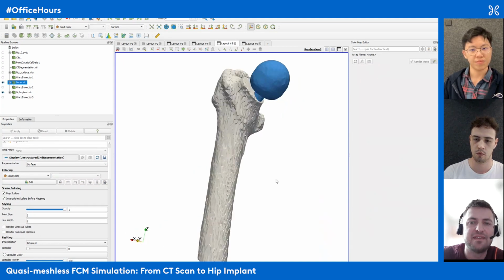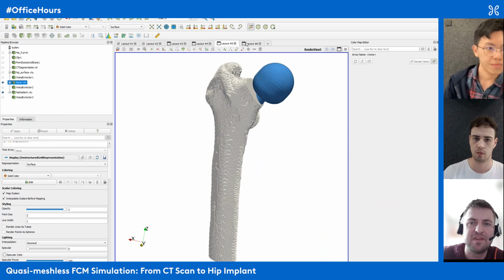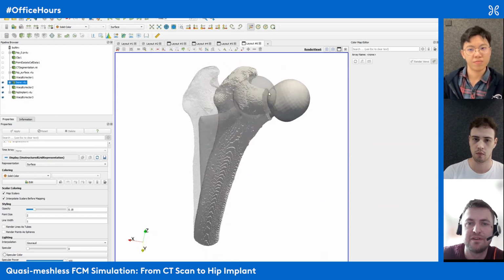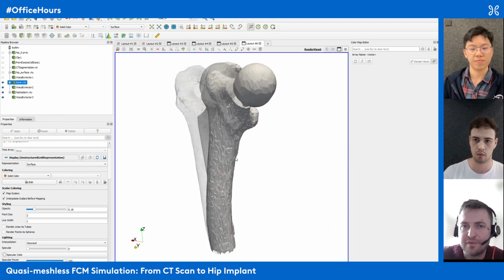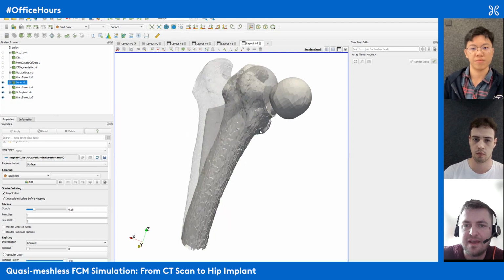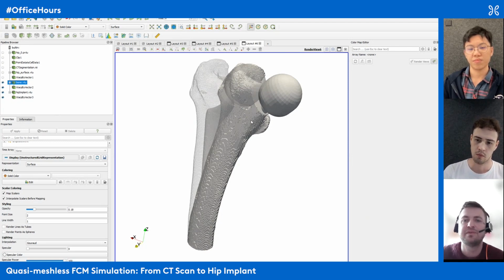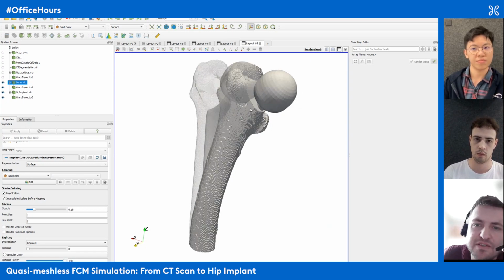I could maybe start from one kind and then look at how that implant shape can be inserted in that bone, and then maybe even look at how that implant plus bone together will deform. Look at the stresses, how the stresses would look in this situation, and then make a decision. Is it good enough or is it not good enough? If it's not good enough, what do we do? We can change how the implant is inserted, or we can try to rotate it or change its position. But actually, we could also change the shape of the implant itself.